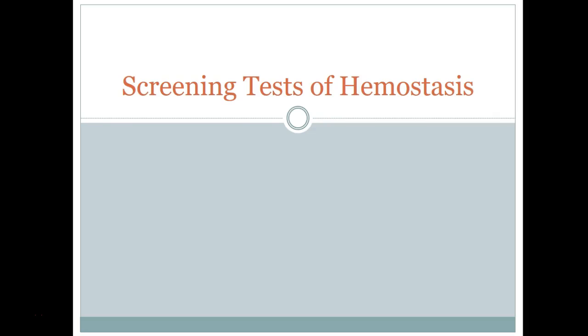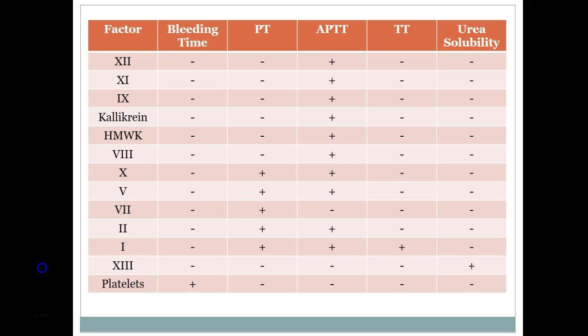Welcome back. Today we are going to cover the screening tests of coagulation. I think this is essentially the second most important PowerPoint within coag, the first being just learning the coag proteins, everything that we did in the introduction to hemostasis.